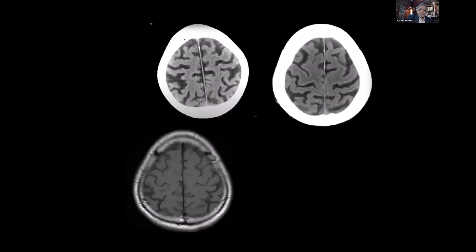Now this is a CT scan. Remember, in a CT scan, you will see the central sulcus much more anterior. Why? Because if I have a head like this, okay, it's my drawing, my drawing is not that bad. Okay. And you have a brain like this.